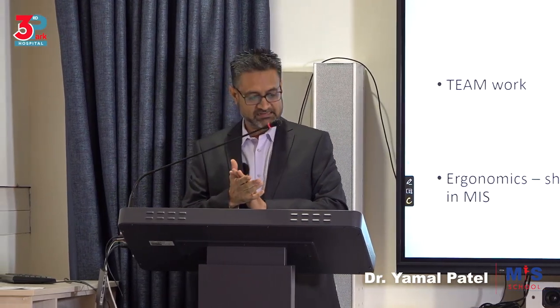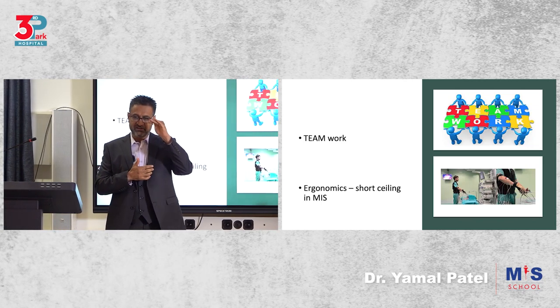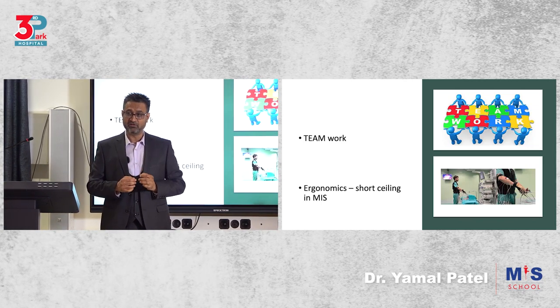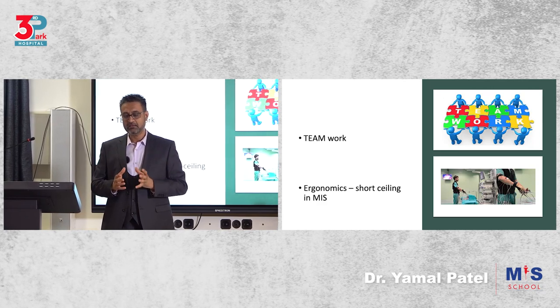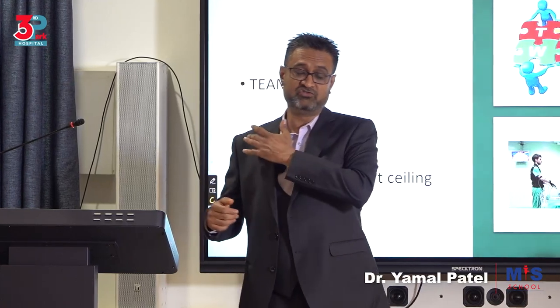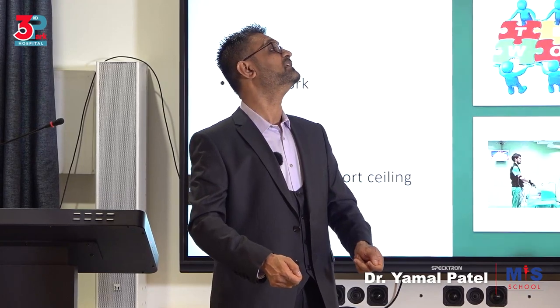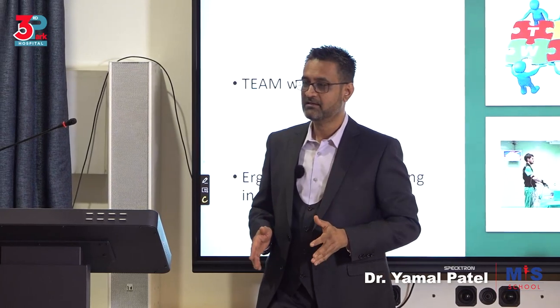So please remember that. Ergonomics: laparoscopy and MIS is going to have a very short ceiling for ergonomics. What does that mean? We'll briefly go through ergonomics, but what it means is it's very easy to injure yourself. We always think patient, patient, patient, yes, but in MIS, we'll also have to think of us, because if you don't, you'll injure your shoulder, you'll injure your wrist, you'll injure your neck because of constant bad positioning of your head to the screen. So please, you need to know ergonomics.